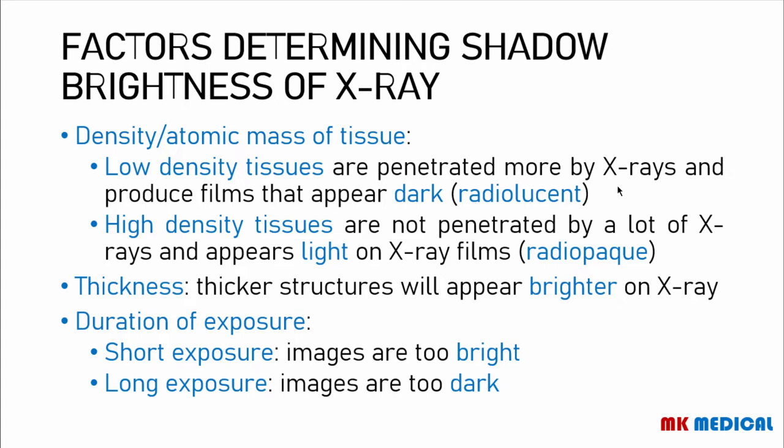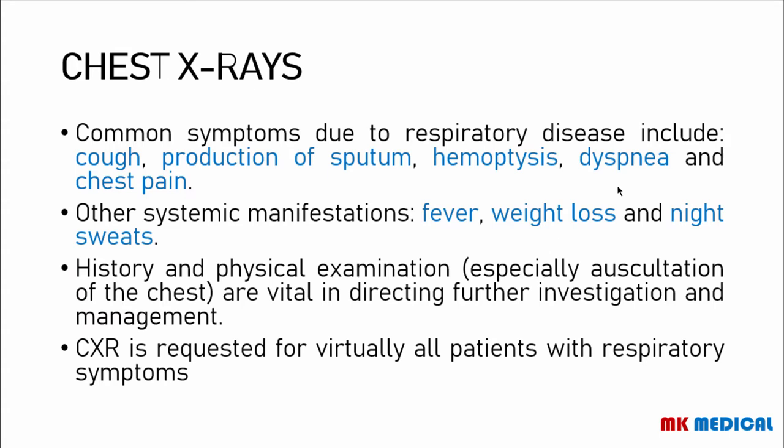So keep these principles in mind, because when I show you a normal X-ray, you will understand why certain structures are appearing the way they are on the X-ray. So remember that chest X-rays are very commonly ordered in practice.